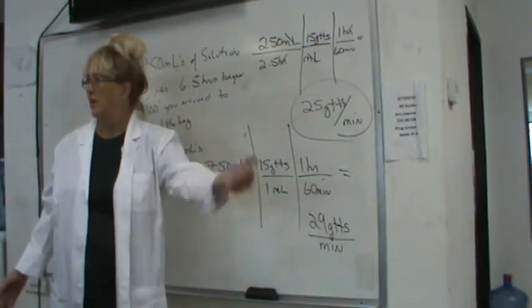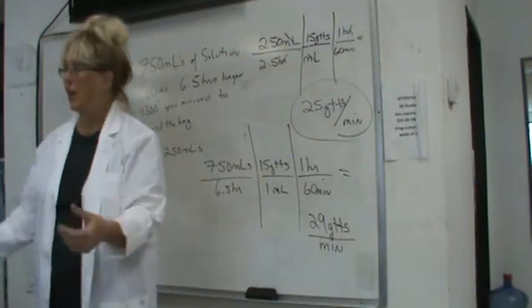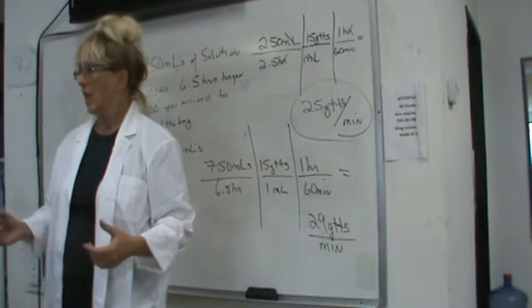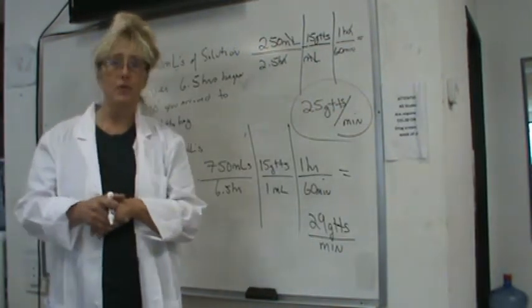That could just be gravity. They're moving their arm, they're getting up, they're going to the bathroom. It goes faster. So actually, we're pretty darn close, aren't we?